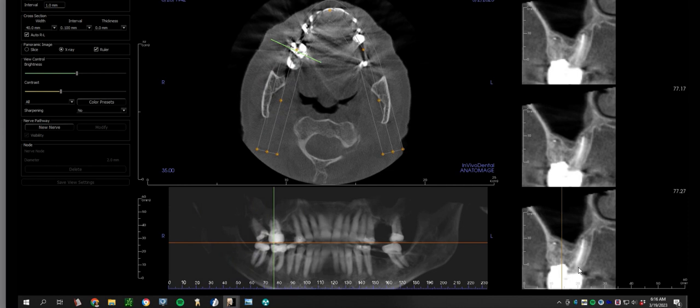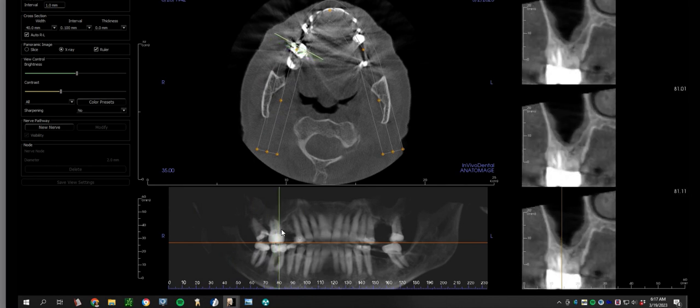I think the scientific world, or at least the dental literature, is going to resolve what to do with these things. I've had this conversation with many endodontists, and in general, if there's no pain, no symptoms, no fistula tract, then they just leave it. That just might be the body's response to a low-grade infection. I can't say whether that's contributory towards systemic disease or not. But in a nutshell, I think it's important to let patients know when we see things like this. So number 3, I would say, is potentially compromised because of that.